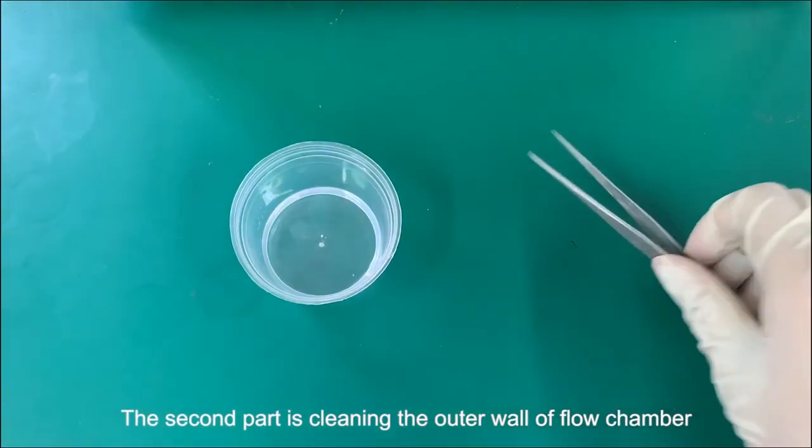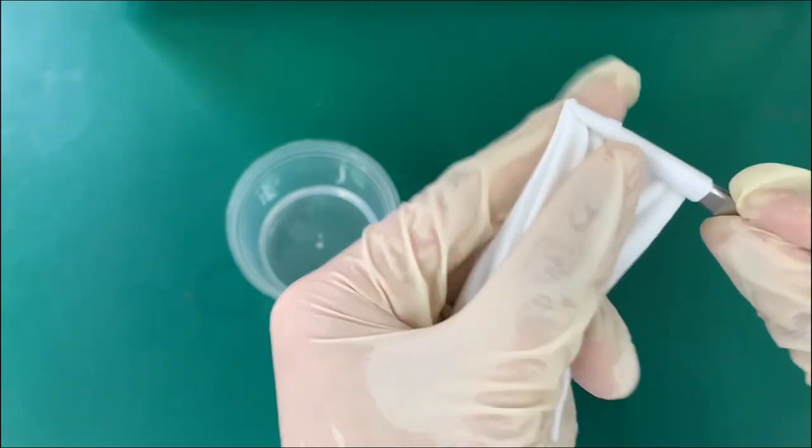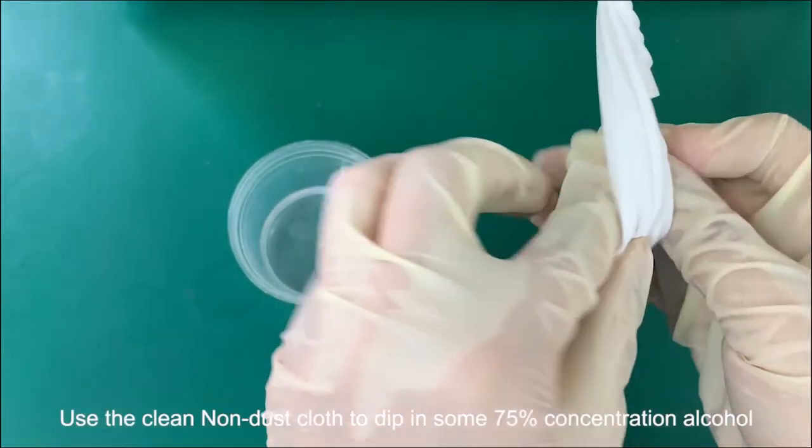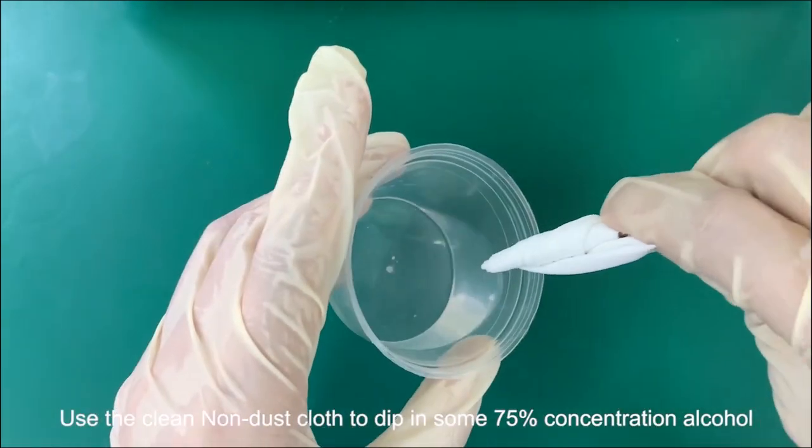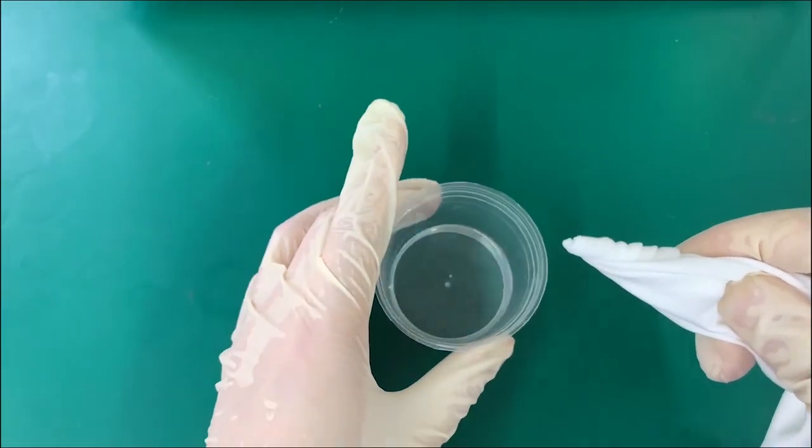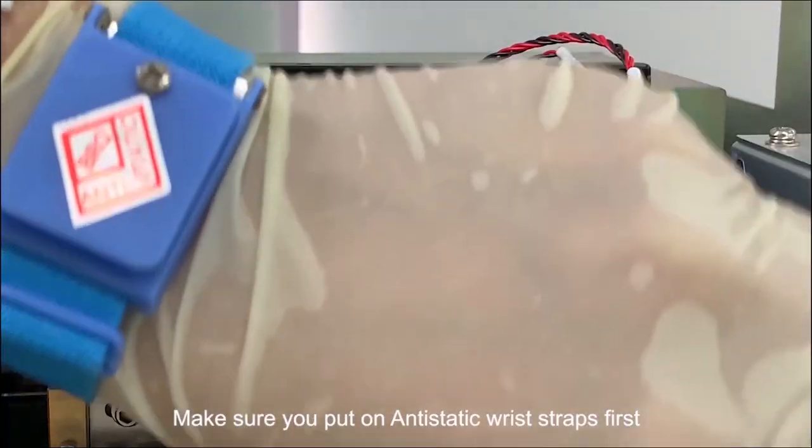The second part is cleaning the outer wall of the flow chamber. Use a clean non-dust cloth to dip in some 75% concentration alcohol. Make sure you put on anti-static wrist straps first.